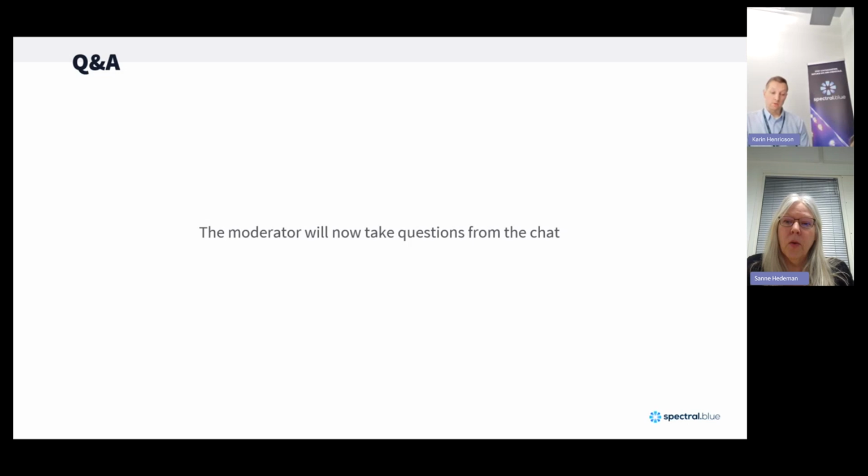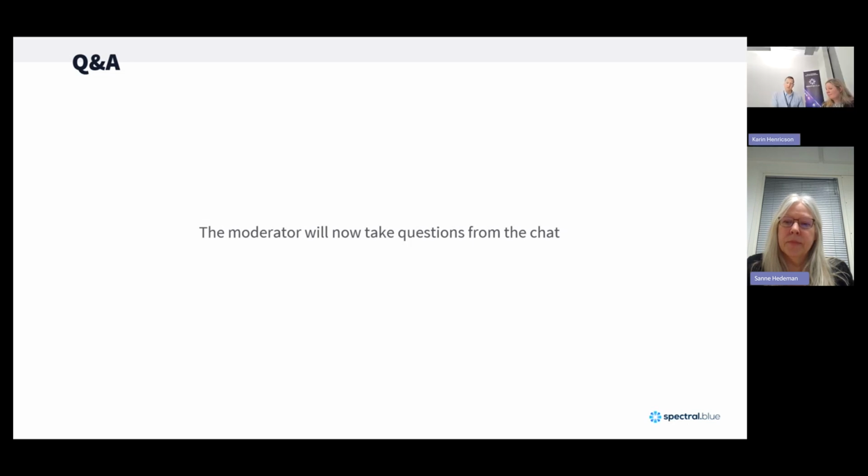Yeah, that's also a good question. Of course, if there are areas where no blue light can reach, there will be zero effect in those areas. But blue light does reflect really well from white surfaces and metallic surfaces, and the blue light rays will actually reach areas that a human operator never could reach. So I would say that we still have better chances than a manual disinfecting agent in that sense. But in areas with shade or shadow, you will have a lower intensity of blue light, and that means that to get the same energy dose as on the surfaces directly under the blue light, you will need a longer time to have an effect.